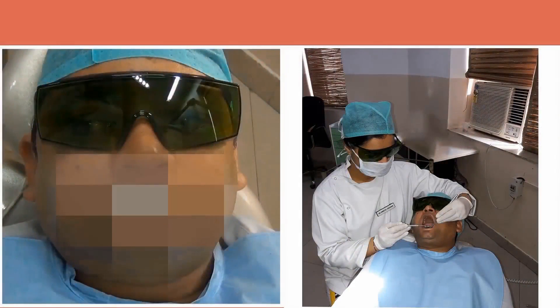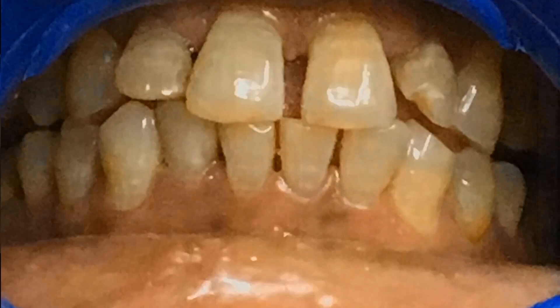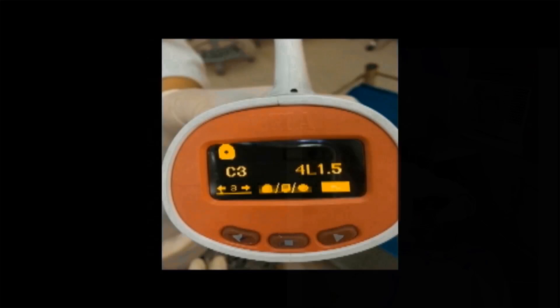Protective eyewear is a must for the patient, doctor and the assistant. Clean and polish the teeth 2 weeks prior to bleaching. Record the baseline pre-operative shade using a spectrophotometer.